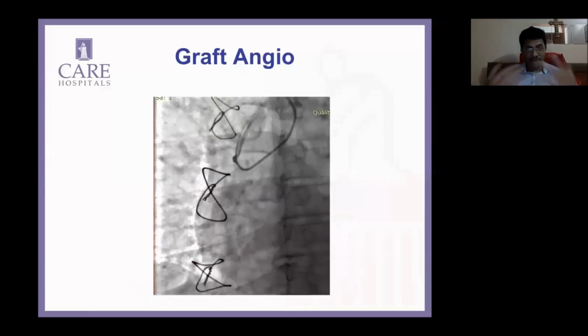And well, he fished around. I don't have the LIMA picture, but the LIMA wasn't grafted. He just injected the LIMA and there was no connection anywhere. So pigtail and everything done, really couldn't make out. This was the only thing he thought was a possible graft, but you know, this could be anything. And that's it. So any comments from you, Sharad?